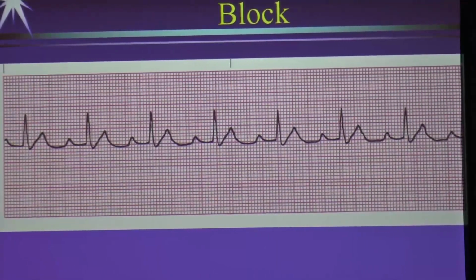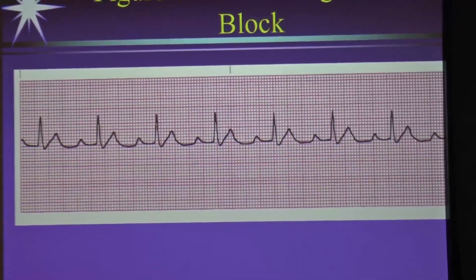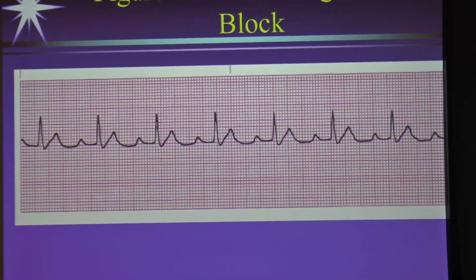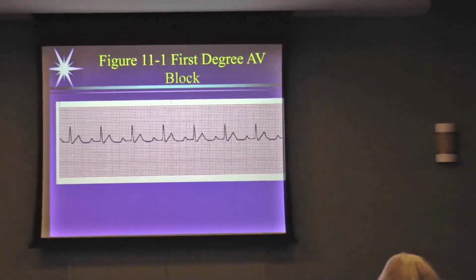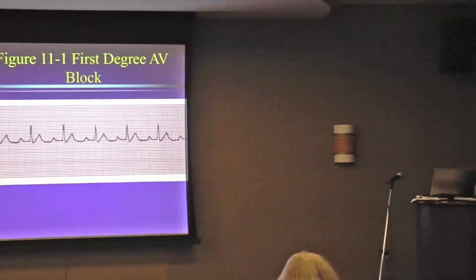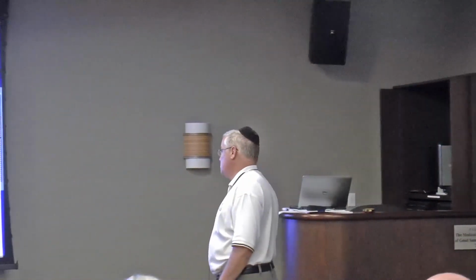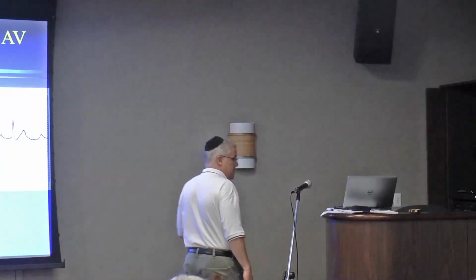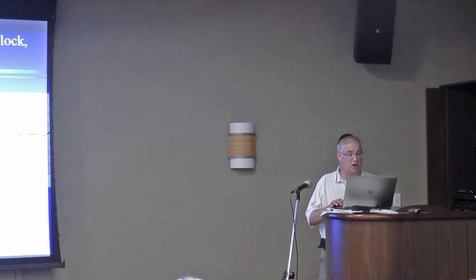This is picked up anecdotally, when somebody is getting a physical, or you get called for something else and you're being diligent, put them on a monitor just to be on the safe side, and you see it. It never gets treated pre-hospitally, probably never gets treated in the hospital. For some reason, the AV node is holding the impulse a little longer than it should. They'll probably come back once a year and get an EKG, just to make sure it doesn't progress to anything higher. So there's nothing really to worry about, nothing to do for these patients. It could actually happen in young, healthy patients who have no underlying issues. Okay, then we'll go on to the next one.